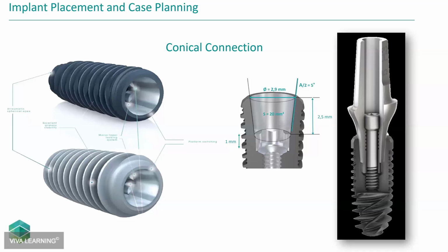Most of the time, you have a harder time removing them than anything else because they really lock into the implant. And with lateral movements, they don't have the micro wicking of bacteria that a lot of people have attributed to bone loss at the crestal area. They are showing to be superior in my opinion, so I don't use any implant that does not have a conical connection.